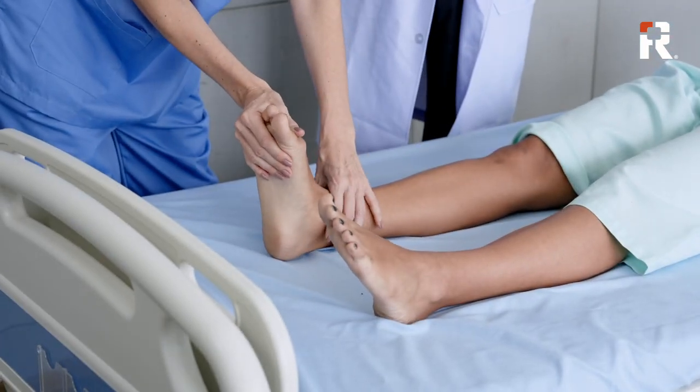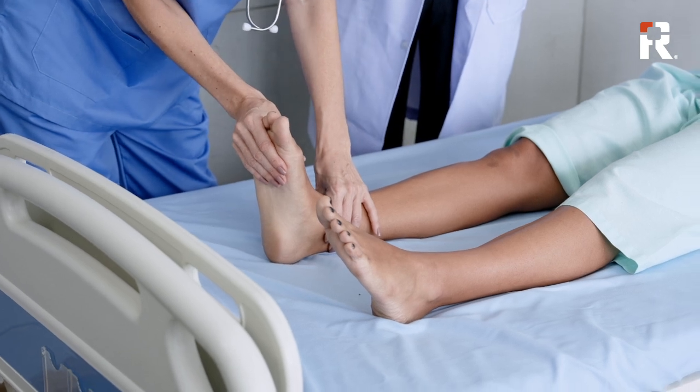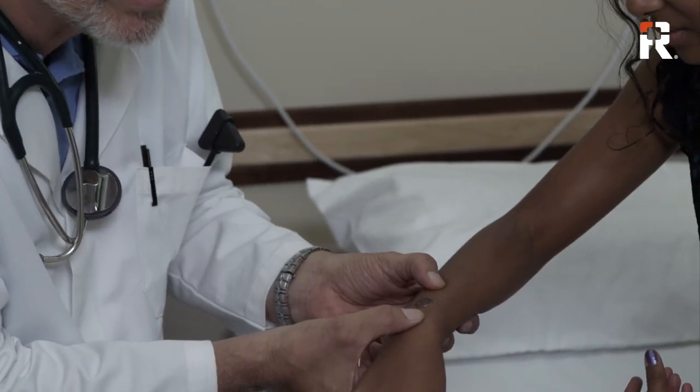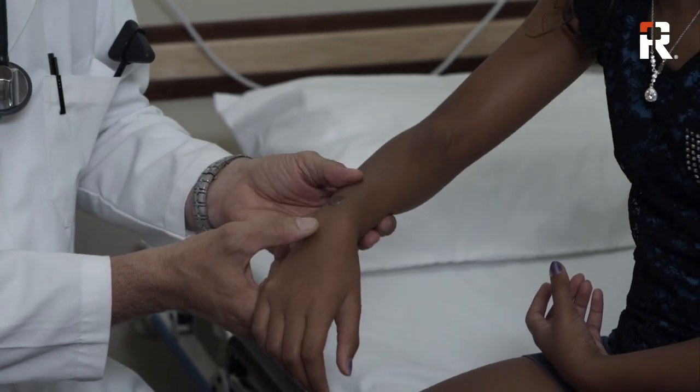Part of this feasibility trial is anybody coming in with an extremity injury of the wrist or ankle is being assessed for enrollment. And if they're proceeding to get an x-ray, in other words, if the treatment team is ordering an x-ray, we'll try to enroll them. They go and get an x-ray. That's the gold standard. That's what's leading the clinical care. And then we try to get imaging acquisition on the Accuro XV platform as well, purely for investigational purposes.